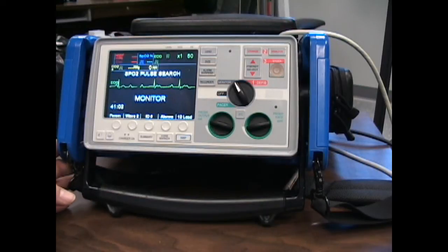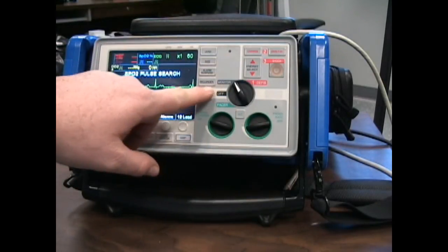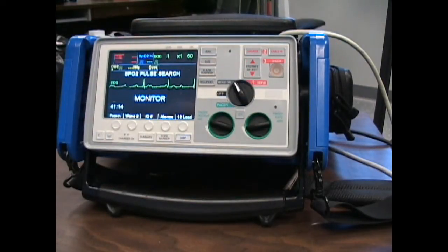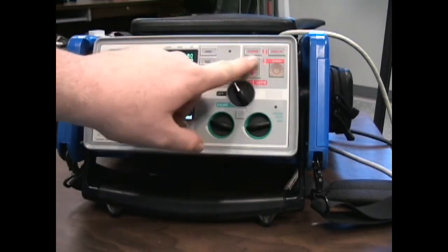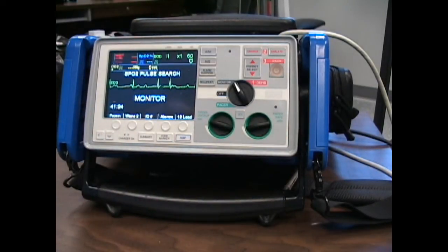Let's go over the Zoll E-Series we carry here at Rocky and Ken EMS. Notice it's a very easy laid-out pad. We have the monitor side, which is gray, and all the monitor buttons correspond to it. To the right of that, we have the defibrillator side, which is red, with all the buttons that correspond to that. Today we're going to be focused on the green section, which is the pacer side.